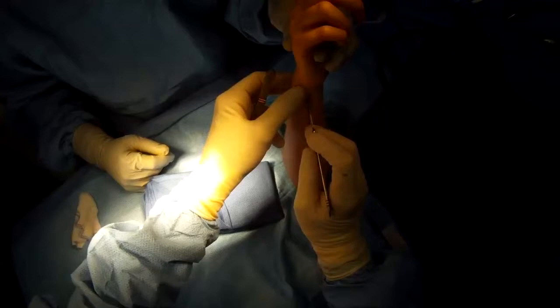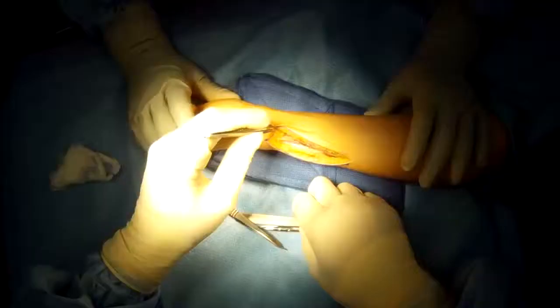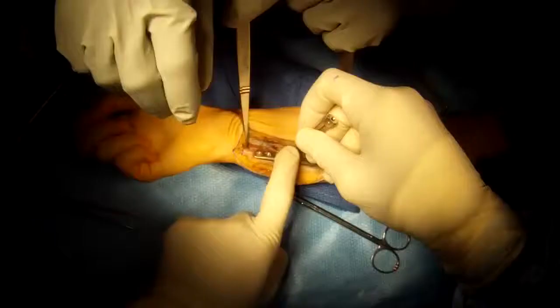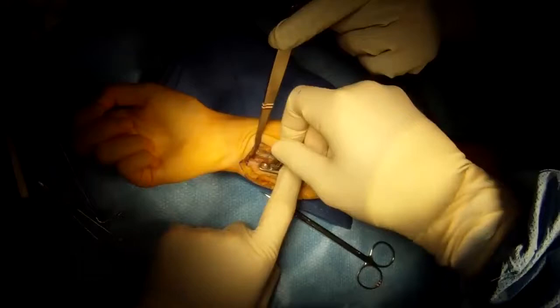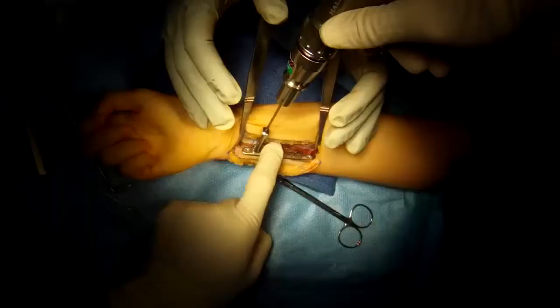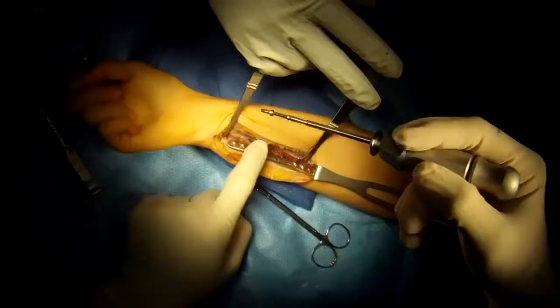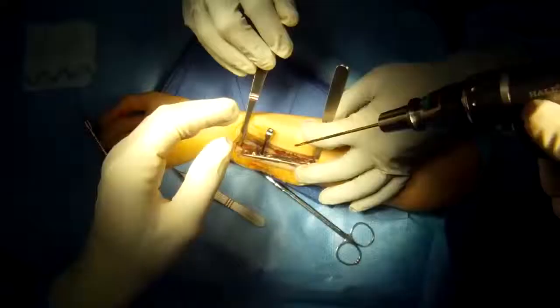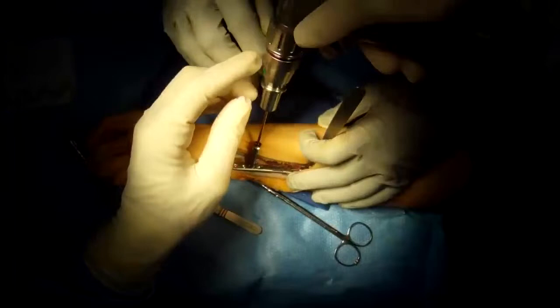This patient has a lunotriquetral ligament tear in the wrist, so we're going to do the traditional ulnar shortening osteotomy. Because that ligament is torn, the bones move against each other; by shortening the ulna, other ligaments are tightened to provide stability to the wrist. I usually use a minimally invasive distal metaphyseal ulnar shortening osteotomy, which heals quicker and is less painful with less scarring, but for this indication — lunotriquetral ligament tears — we need to do the traditional full open ulnar shortening osteotomy.